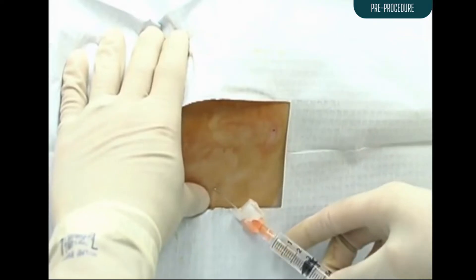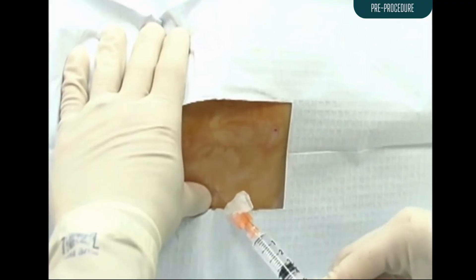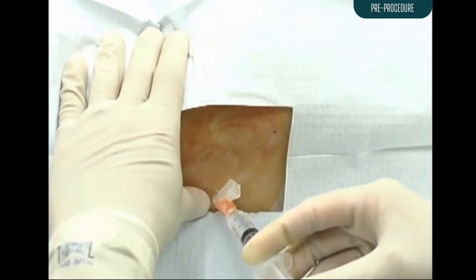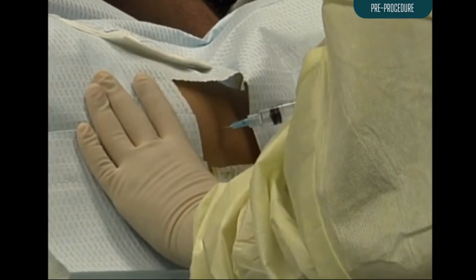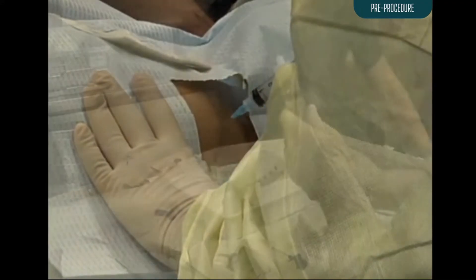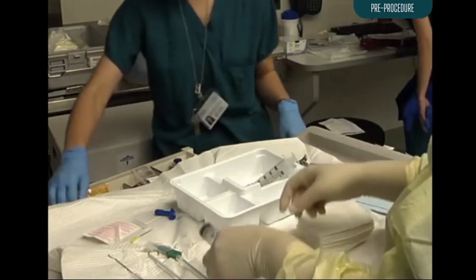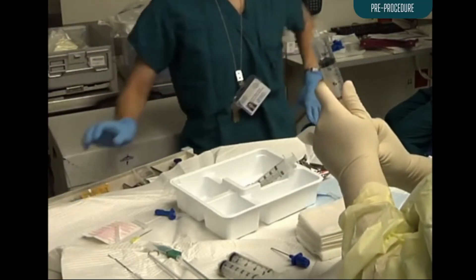After sterile preparation, 1% lidocaine should be slowly injected to raise a wheal over the biopsy site. Then infiltrate the periosteum with 2 to 5 mL of buffered lidocaine. In the awake patient, ensure the adequacy of local anesthesia by gently tapping the periosteum with the tip of the needle used to deliver the anesthetic. Be sure that you have prepared the appropriate number of 30 mL syringes with and without heparin prior to starting the bone marrow aspiration.